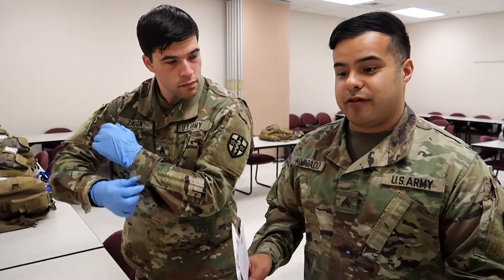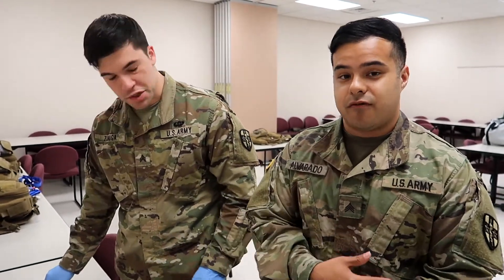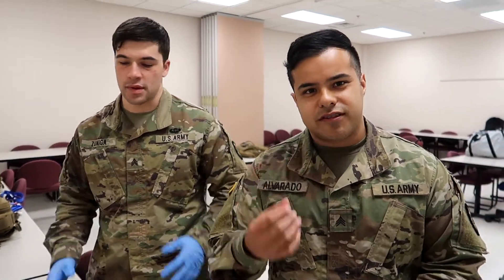Typically, what some of us did when we were in AIT — and even when I was at my unit — we put baby powder or just some chalky material inside our gloves beforehand. When you go to Camp Bullis, your hands are going to be sweaty. If you put baby powder in there, it makes them real smooth to slide on — they don't get stuck on your skin or anything like that.